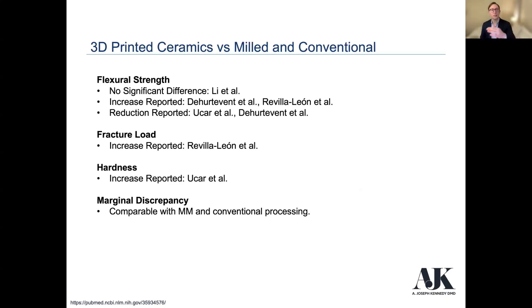We saw an increase here. We saw an increase in the flexural strength in 3D printing versus milled. In these articles here, a reduction was reported. What I'm trying to get at with this slide is that still, the research is varied. Many of this, if not all of it right now, from what I can tell, is all benchtop in vitro studies. So I do want to see more of the scientific basis before going all in on this type of tech. But it's been very promising.